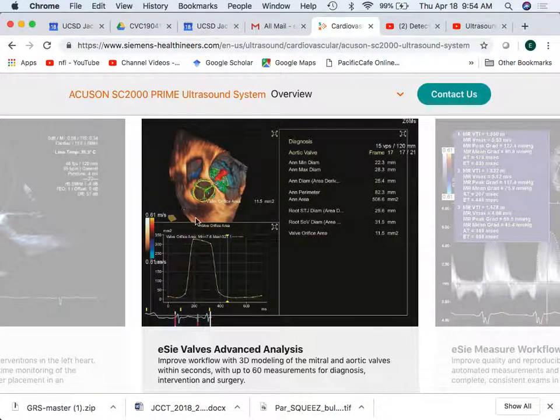Here's another example, this is 3D echo, where you don't just sweep to make a 2D picture, you sweep in two directions to make a 3D picture, right? So now we're going to start running out of data. If you look at the frequency with which we were getting those B mode data, now I want to sweep that over a 3D volume and make a 3D picture, right? So there might be a problem in the problem set about that, just like what frame rate do you expect from a 3D ultrasound picture?